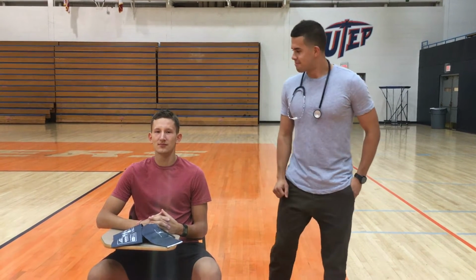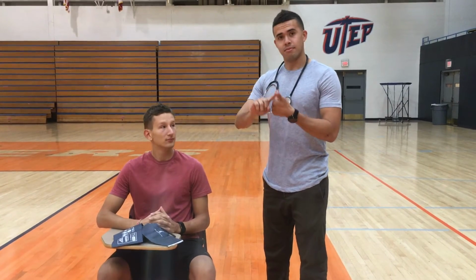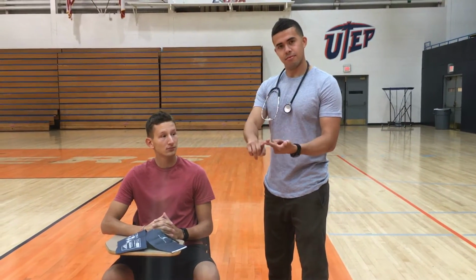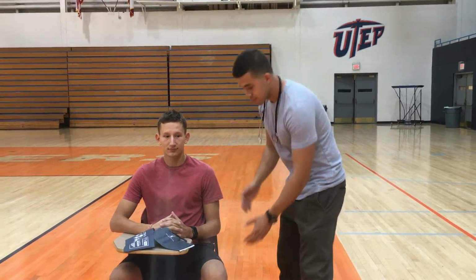Hello. Before beginning the assessment on our client, we need to make sure of three things. We make sure the client has rested for at least 5 minutes, has not ingested caffeine or nicotine for at least 30 minutes prior, and the measurement should be taken on a bare arm resting at heart level.